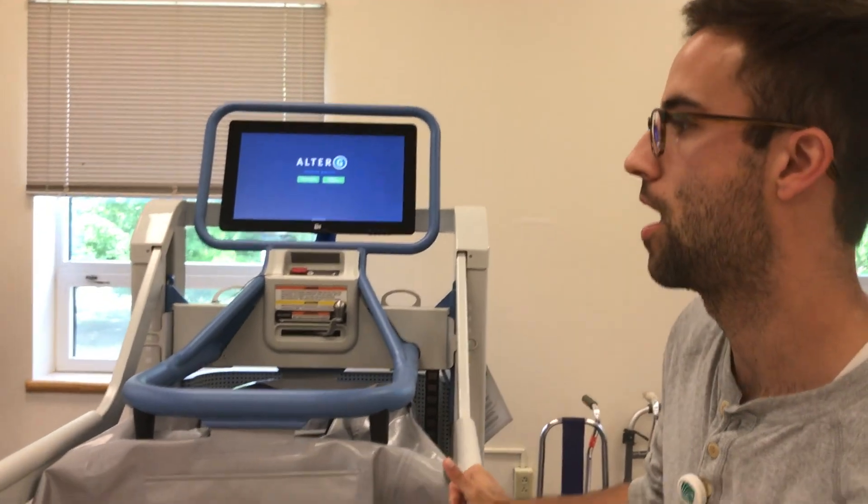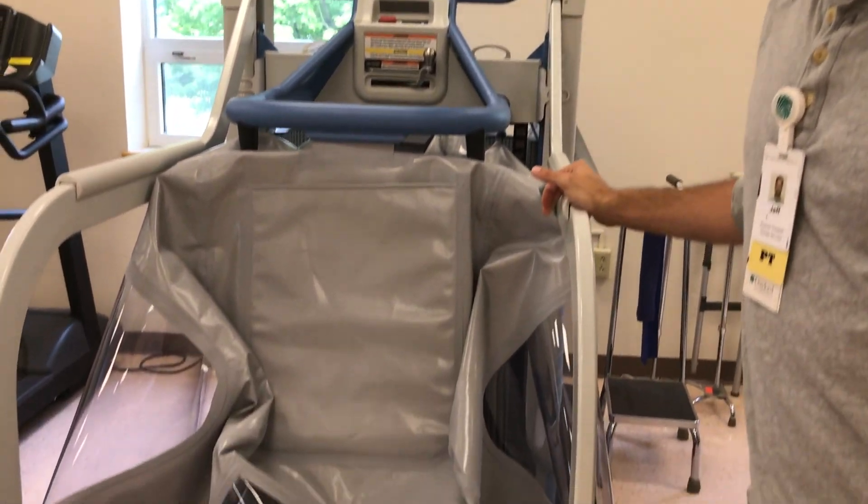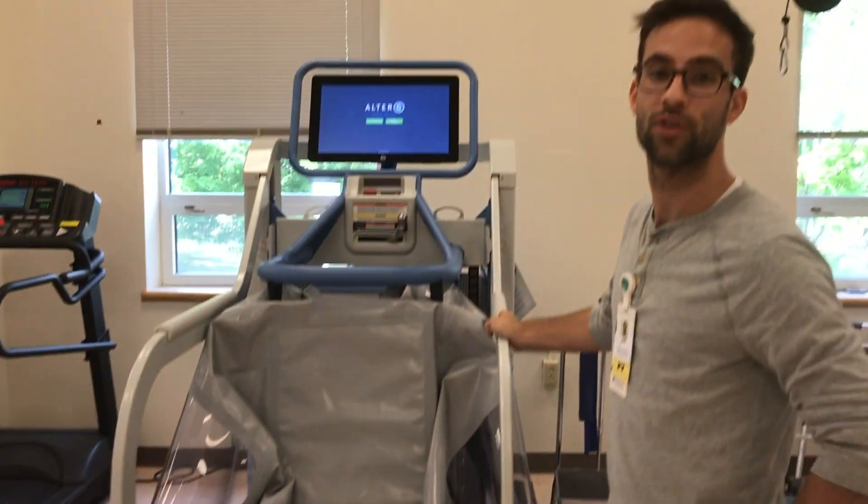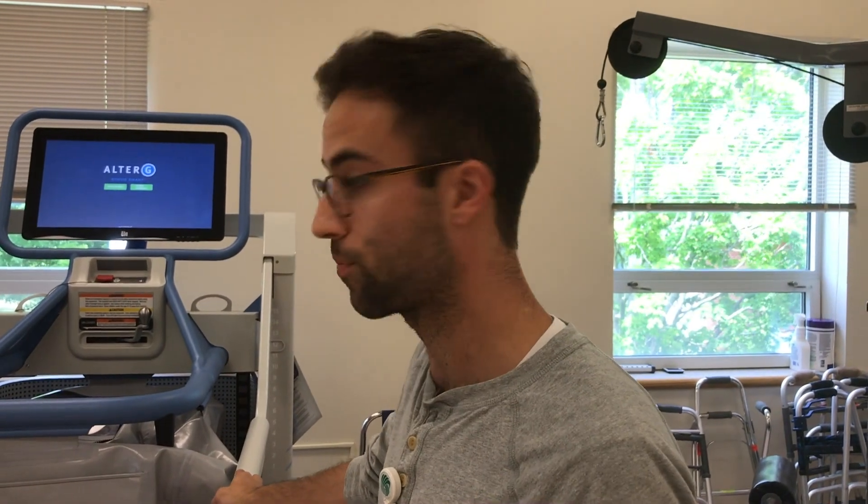Most of these are used in outpatient sports facilities for returning to running, high-impact activities, and things like that. But here at Gaylord we use it a little bit differently — mainly retraining weight-bearing, improving your ability and quality of step length, stride, weight-bearing symmetrically, and pretty much any type of static balance activity you might like.